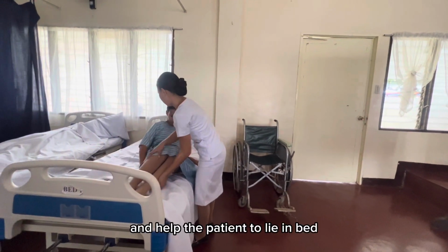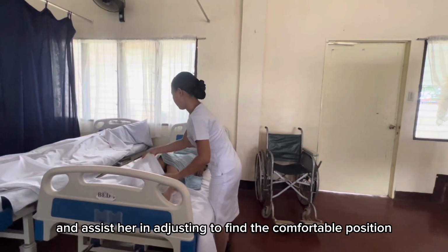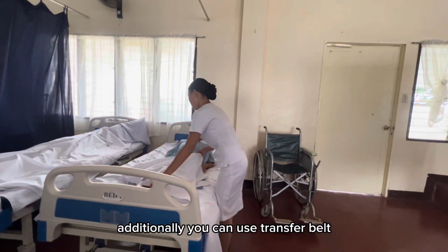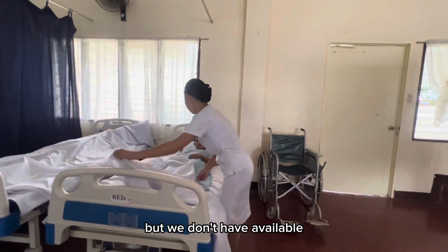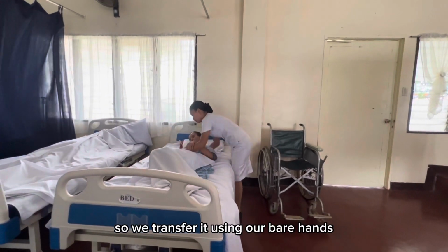And help the patient to lie in bed and assist her in adjusting to find a comfortable position. Then, put the blanket on. Additionally, you can use a transfer belt but we don't have one available, so we transfer her using our bare hands.